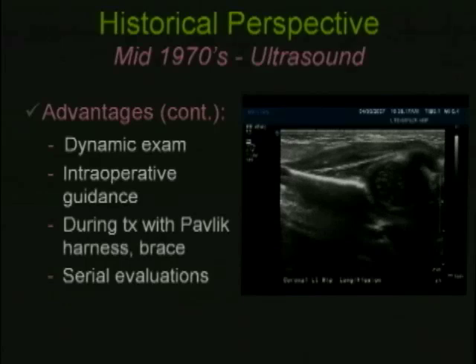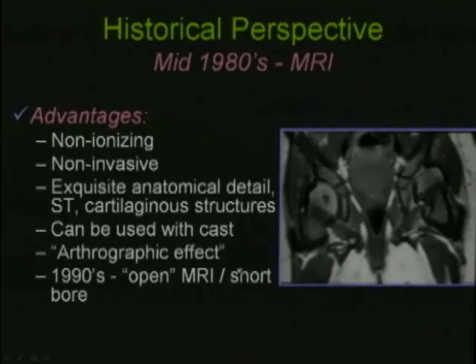It could be used during intraoperative guidance during reduction, and can be used during treatment most easily when the child is being treated with a Pavlik harness or a brace. And then we can use it for serial evaluations in a regular fashion until the hip is appropriately treated and there's no longer a need for the harness or the brace.